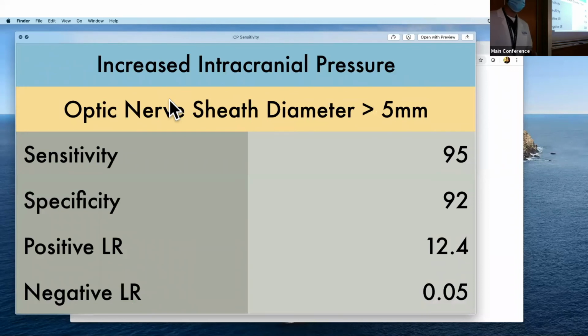Right. Awesome. So how does that compare with the ophthalmoscope? On physical exam, it's notoriously terrible. Like the papers that come out for that, people can't appreciate papilledema with an ophthalmoscope, especially across different specialties. Because I'm biased, the studies I look at are always the ER ones. And it's how many times could they actually accurately appreciate papilledema? I can't remember, it's like 40% or something very small. So because that's so small, it's not necessarily a skill that we teach and practice that much, which then just cascades into even more inaccuracy at being able to appreciate that.